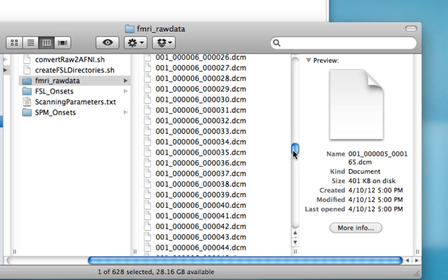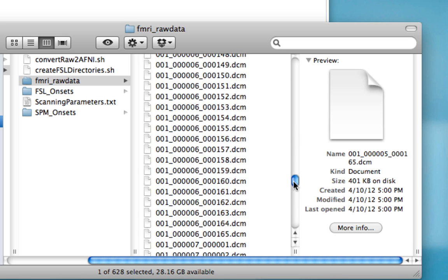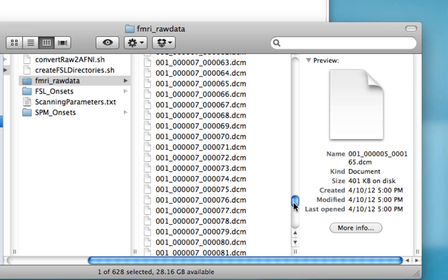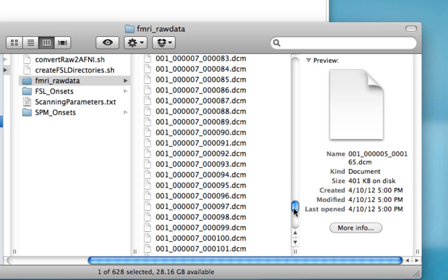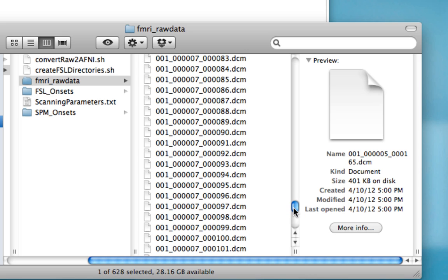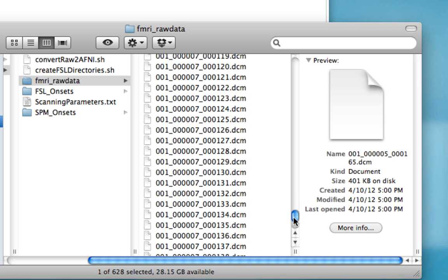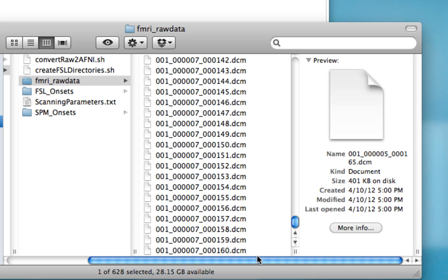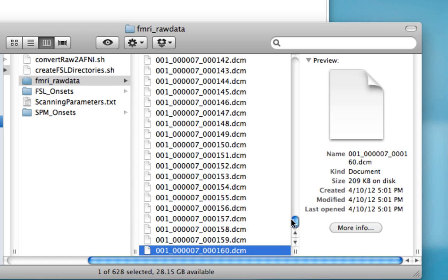Run six is the same, and when we get to run seven, it should end at 160 volumes, because it is an anatomical run. And we see that that is also what happens. It's good to check for this just to make sure that there are no runs or volumes that are missing.